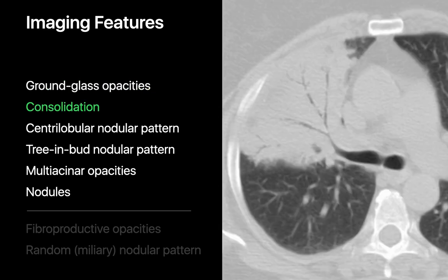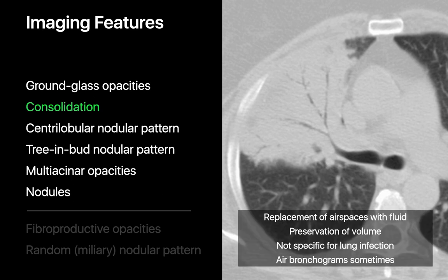We look for consolidation — when a region of lung appears so dense that underlying anatomy is not visible on unenhanced CT, like trying to look through a car's metal hood. With consolidation, air spaces are replaced by fluid, so lung volume is usually preserved or increased, unlike atelectasis or fibrosis. Lung infections can cause consolidation, but so can pulmonary edema or alveolar hemorrhage. Bronchi within consolidation may remain patent, resulting in air bronchograms, though these are not specific for consolidation either.